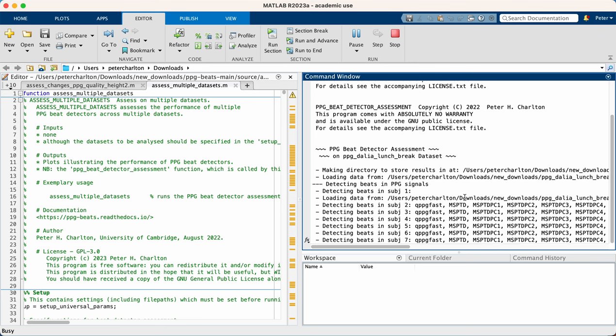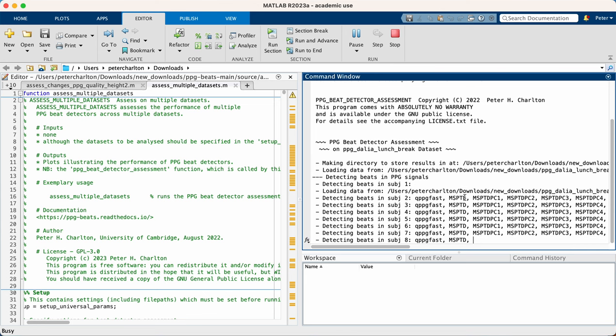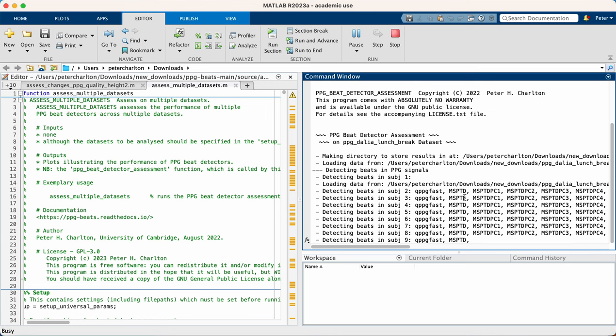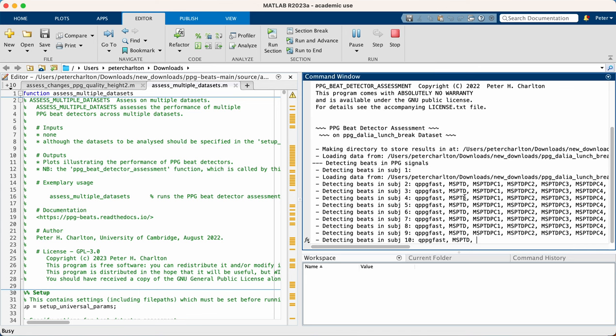And here we're looking at both how accurately each version detects beats in the PPG signal, and also the execution time of each version, aiming to maintain the high accuracy of MSPTD, whilst reducing the execution time, i.e. making it more efficient. So it's now going through each of those subjects.